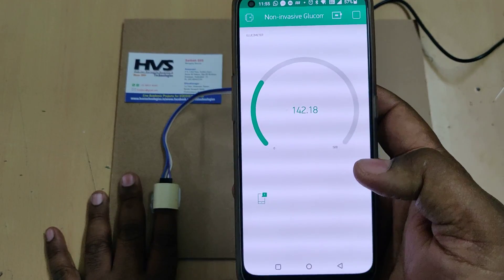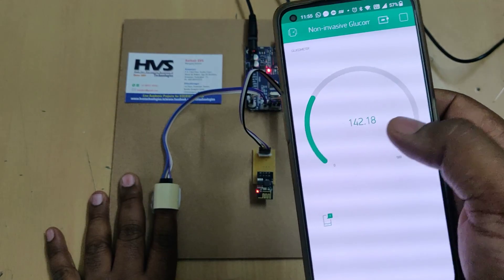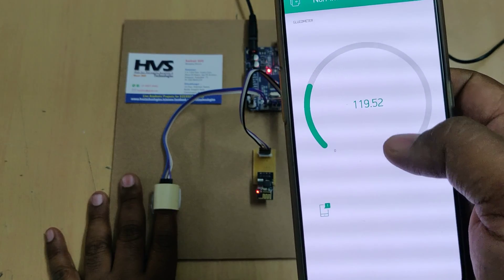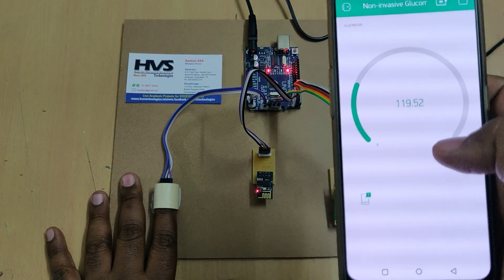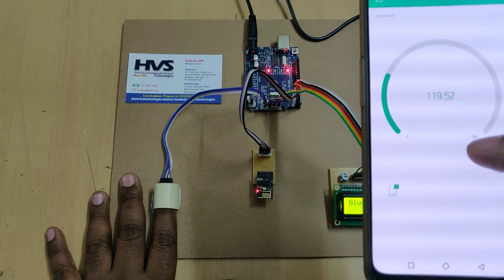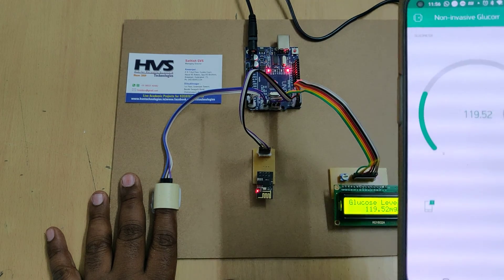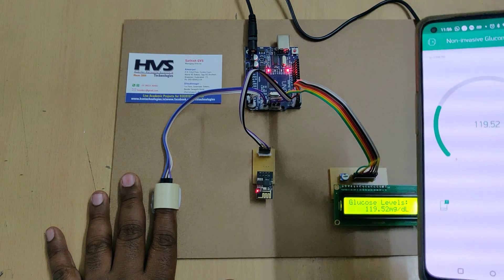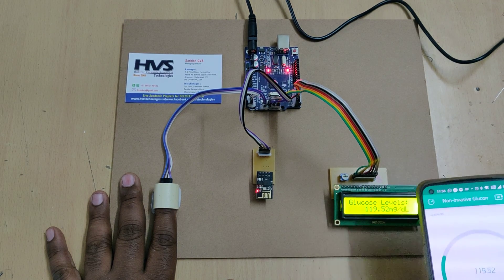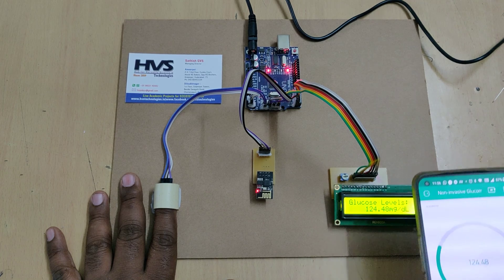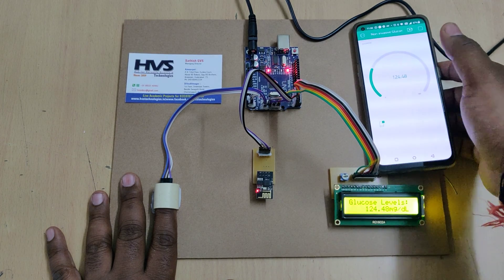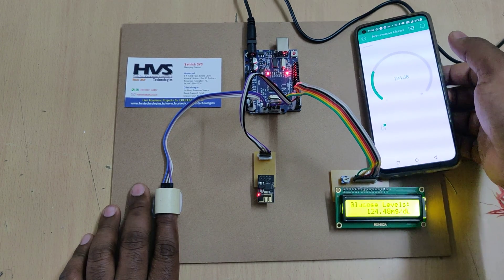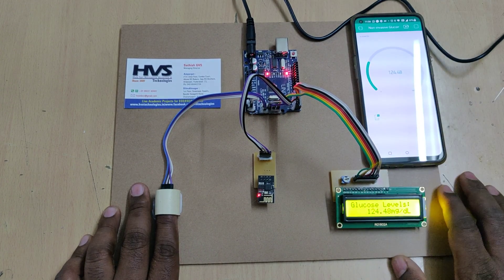When moving the finger, the values fluctuate and won't stabilize. We have set limits: if the glucose level is above 150, you will get an alert notification on your mobile phone; if it is below 60, you will also get an alert notification. The readings are in milligrams per deciliter.